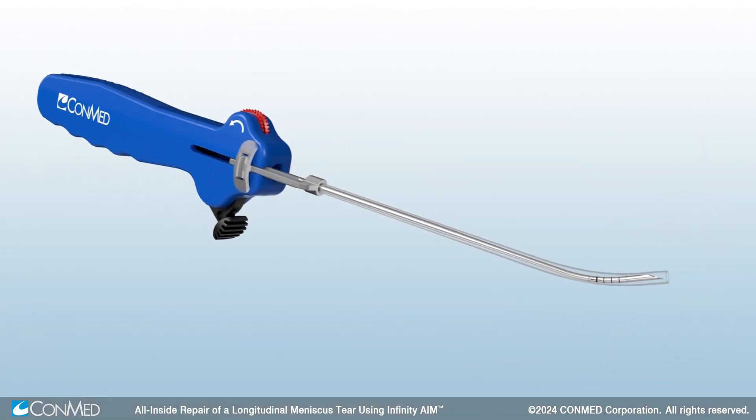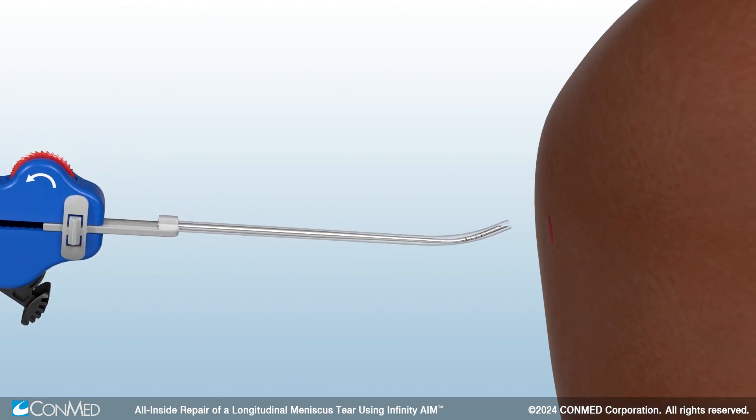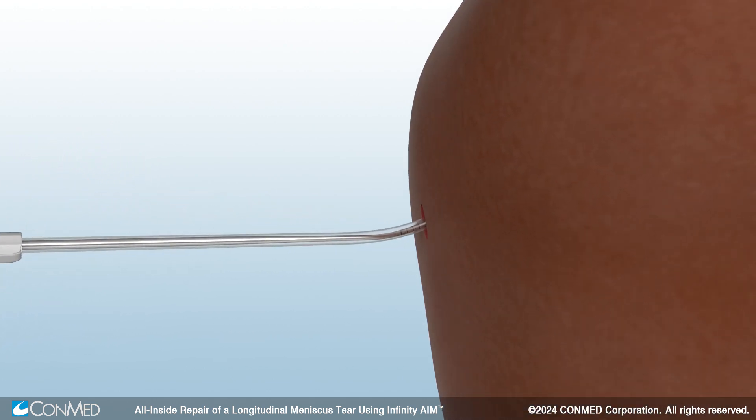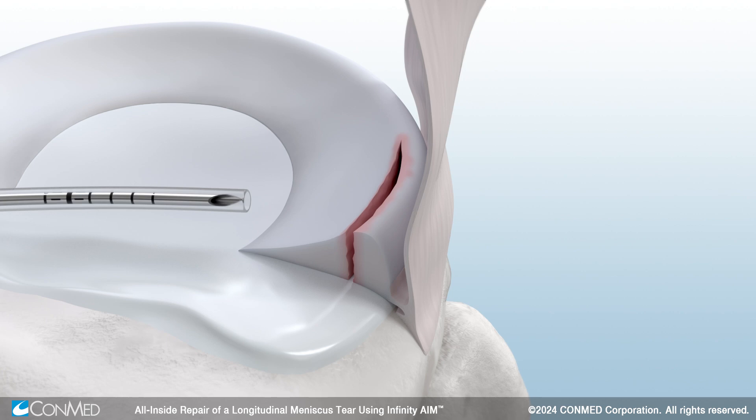The Infinity Aim 25-degree standard curve option is used to close the superior gap and compress the upper part of the meniscus. With the adjustable sheath fully covering the needle, insert the Infinity Aim device through the working portal. The adjustable sheath allows this step to be done without the need for a meniscal sled.